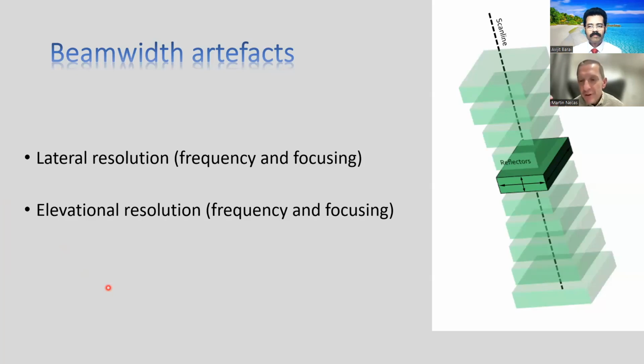The pixel of information on the ultrasound display is very narrow up and down. It means we have good axial resolution, but it's quite wide. We have poor lateral resolution that's mainly affected by focusing. And the ultrasound image is also quite thick. That's the elevational resolution. The in-plane lateral resolution is affected by your user adjustable focus. The thickness of the image is related to the transducer design, because along the transducer surface there is a lens that focuses the thickness of the plane and tries to limit the thickness of the slice.